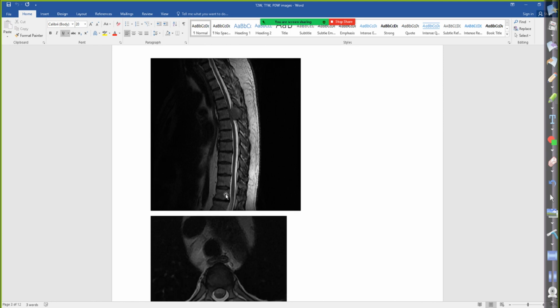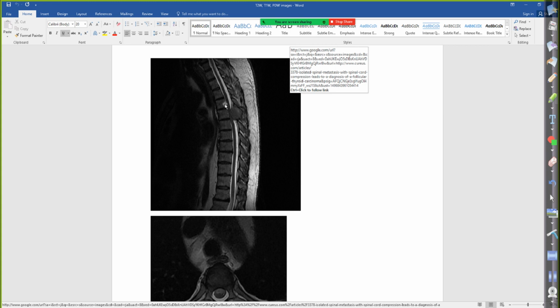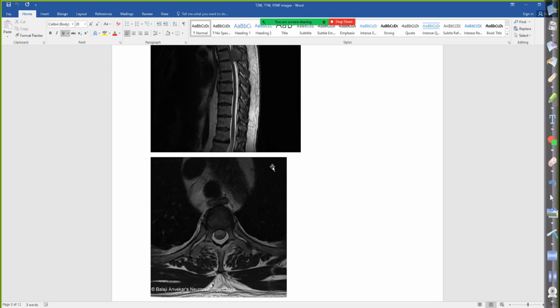Moving down to the T-spine, lateral T-spine. CSF is still bright. See how fat is bright, technically, but not as bright as our CSF. We have some kind of pathology here, too, impinging on the spinal cord. We don't know what type of pathology that is yet, but we know it's something there. It's not fluid-filled because it's not bright, so maybe it's some kind of vascular-fed cancer or lesion.